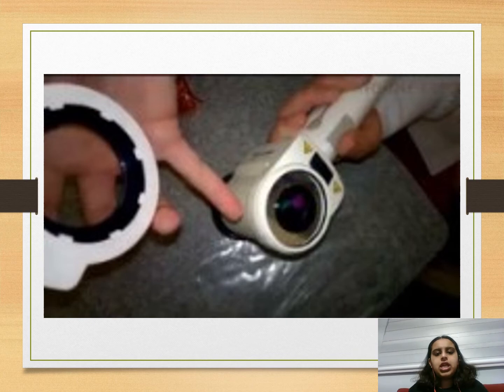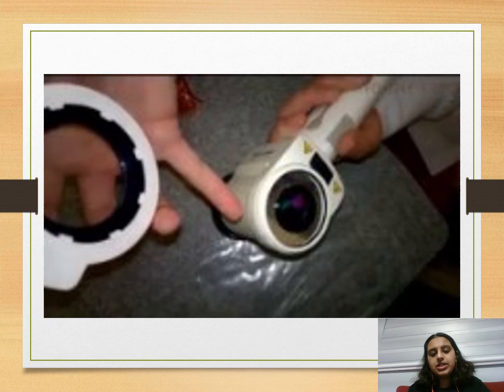One important thing to mention is that it's not a diagnostic tool. Anytime cancer is detected, it is sent to an oral pathologist and you need to do a biopsy or further testing. This is just to see if there are any lesions that seem a little atypical, and then we want to find those findings and send them off to a specialist. So she's just showing the device there.